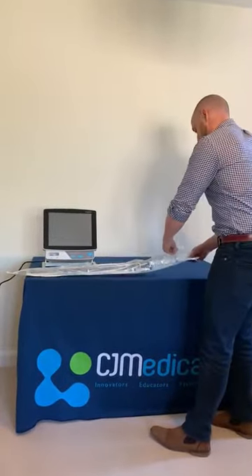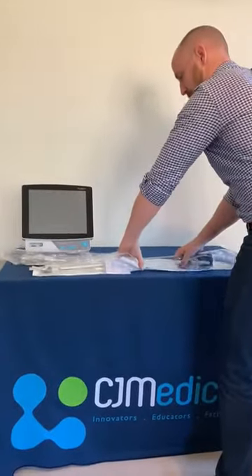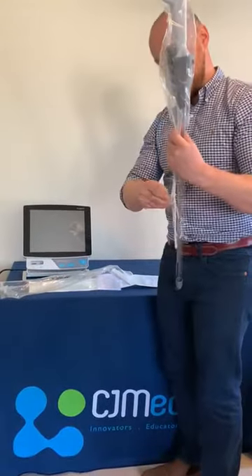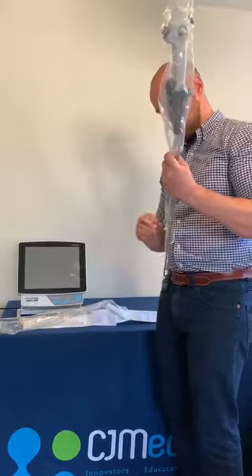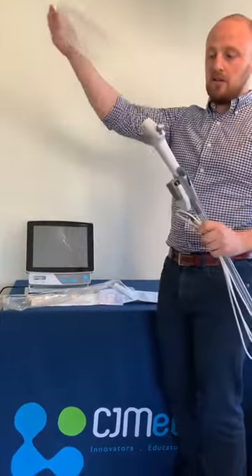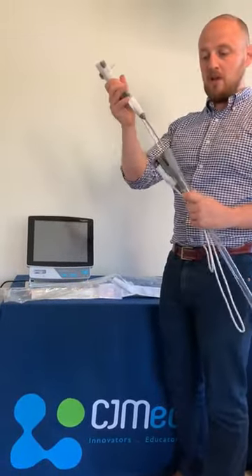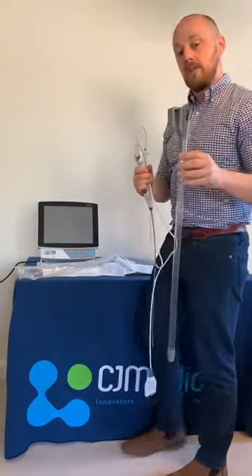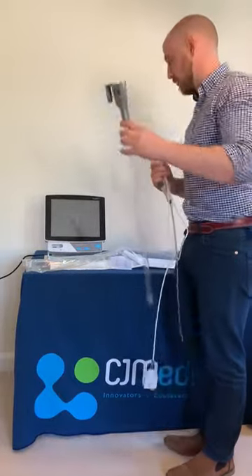To open the device you would unpeel it from the pack, take the scope out, take the clips off that keep the cable tied up. Take the bag off the end, take the scope out of its sheath. That needs to be then left somewhere where you can access the scope again, so ideally clipped next to a patient's bed or somewhere accessible.